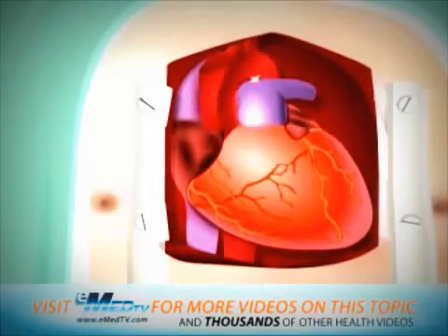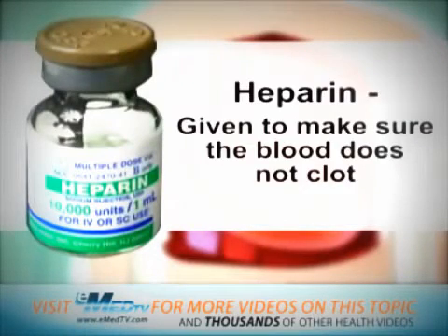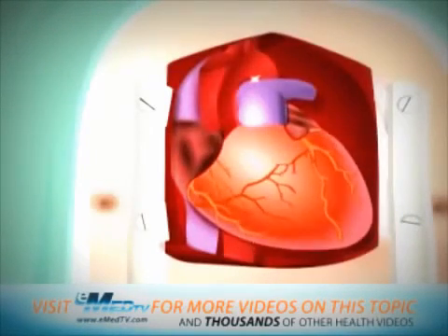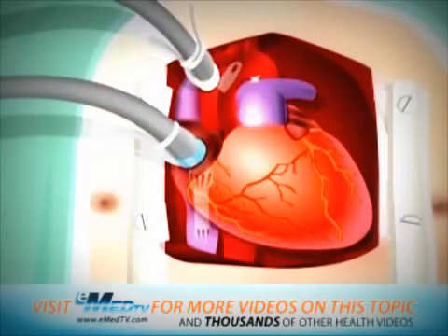After giving a large dose of a blood thinning medicine called heparin to make sure that the blood does not clot, the surgeon will connect the heart to the heart-lung bypass machine with a plastic tube. Blood from the heart is then sent to the bypass machine through this tube. The machine supplies the blood with oxygen and then pumps it back to the rest of the body through the other tube. While connected, the blood simply bypasses the heart and lungs, but still reaches the rest of the body.